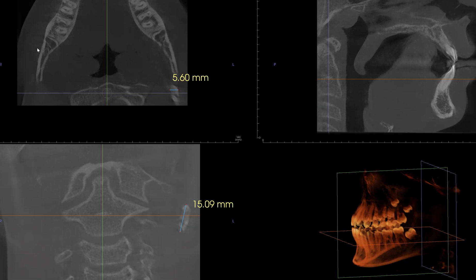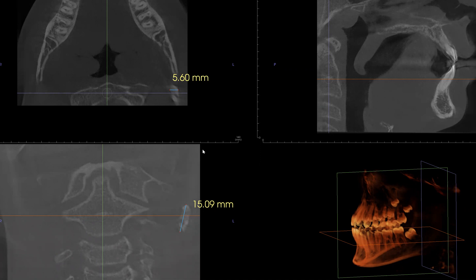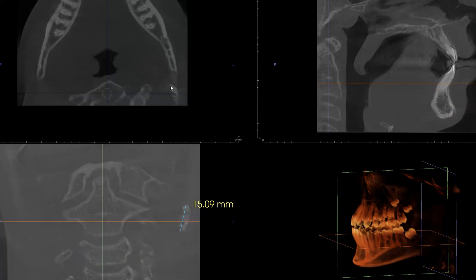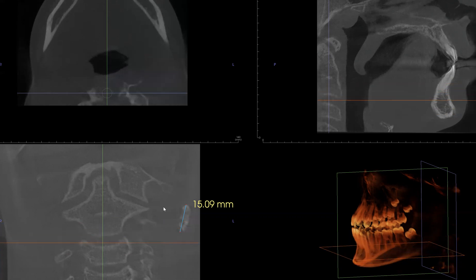From this CBCT scan that was submitted from an outside clinician, we see that there are incidental findings of multiple calcifications within the soft tissue of the left neck. You can see that there are quite a few calcifications located just behind the ramus, and even at the level below the angle of the mandible.